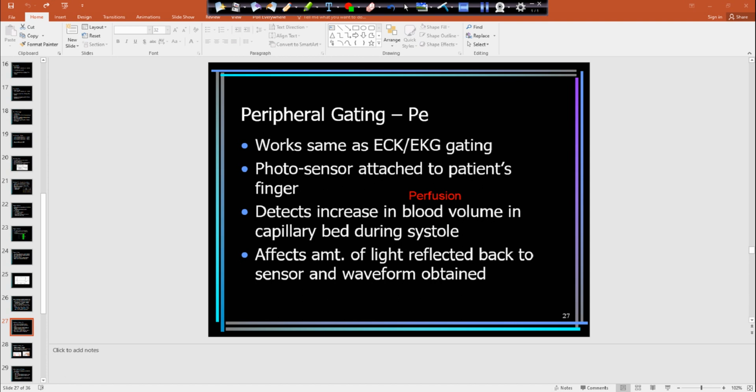They usually say increase your cc's per second to what? I know your CIs have you change it on your power injector, because anytime you do a perfusion, you have to use the power injector. You can't inject quick enough. 3 to 4 cc's per second. So normally you just hand inject like 1 to 2 cc's per second. But for a perfusion scan, we're injecting a lot faster, 3 to 4, even 5 sometimes cc's per second.